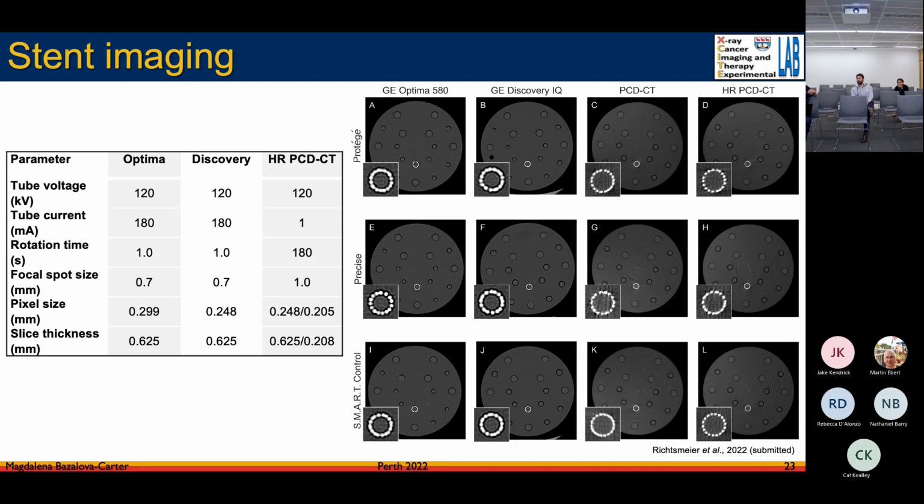If you were to compare with something, I think you might be better off comparing to a Revolution with a 16 centimeter detector, or with a Siemens Flash dual X-ray source scanner. If you're comparing it to what are basically workhorse scanners built for other purposes than simply diagnostic, it might be that the comparison was a little bit flawed.